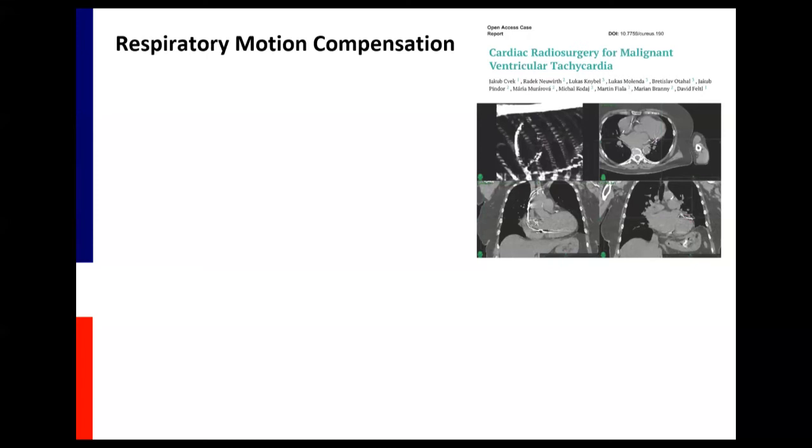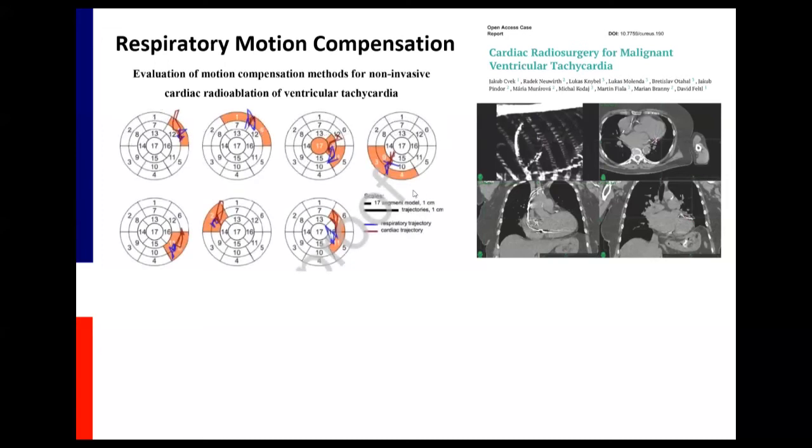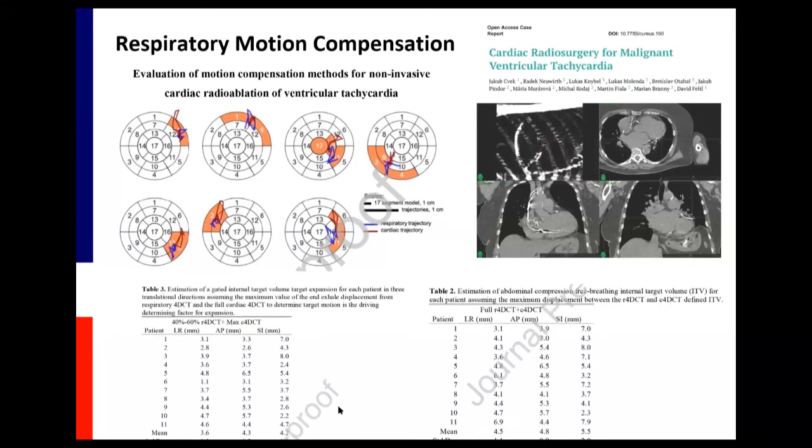And also when you do Linac-based treatments, and this is the group from St. Louis, they have checked their motion, actually cardiac motion and respiratory motion, you see is not really that high. And they compared the motion between abdominal compression and free breathing ITV approaches in their patients. And you see the difference is really not high. So they see motion only of 5 millimeters, respiratory motion, and either with free breathing or with abdominal compression. And they could really also use with this cone-beam CT, they use the leads as well, the ICD leads for registration during treatment.